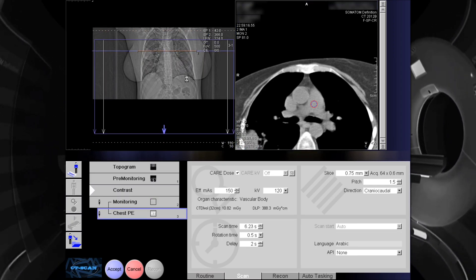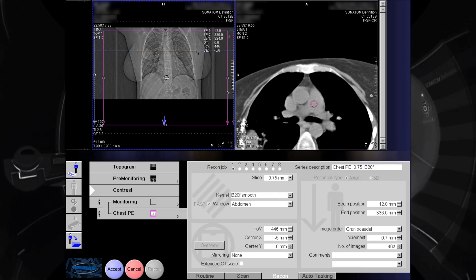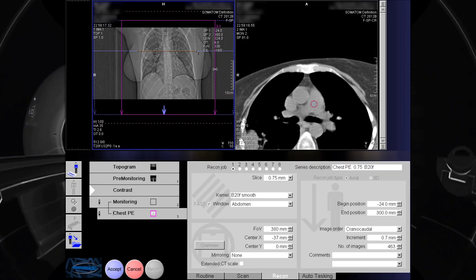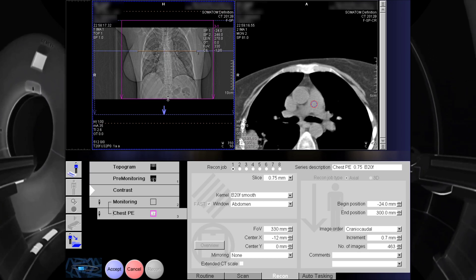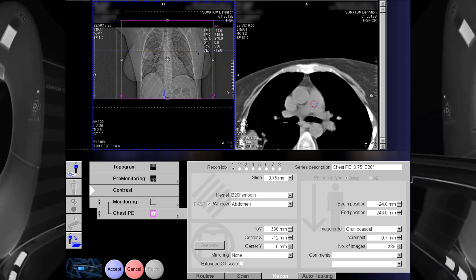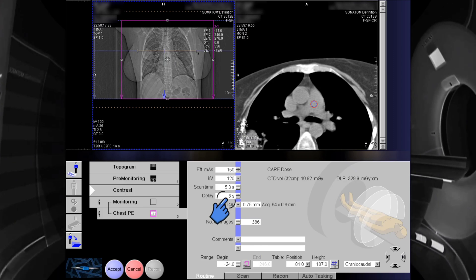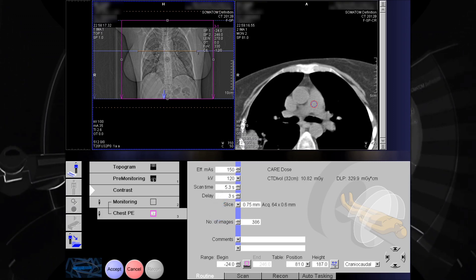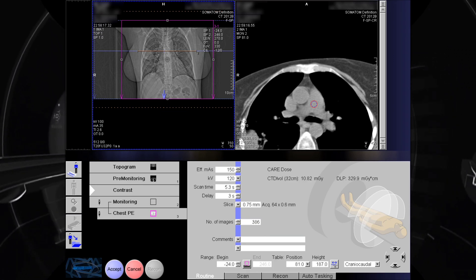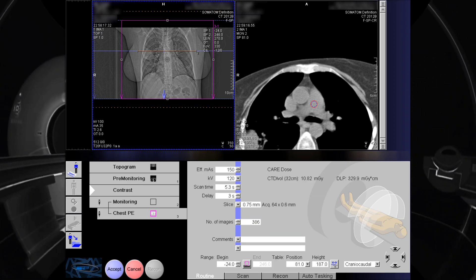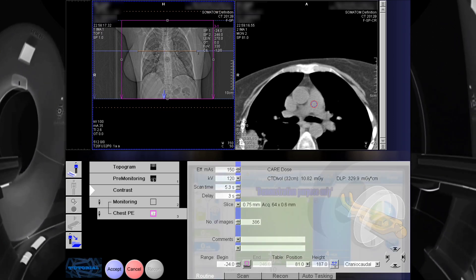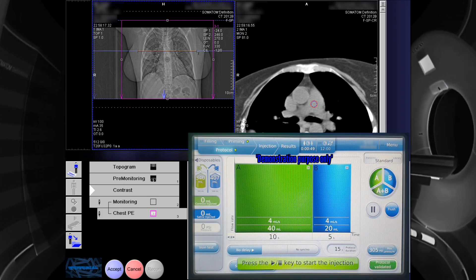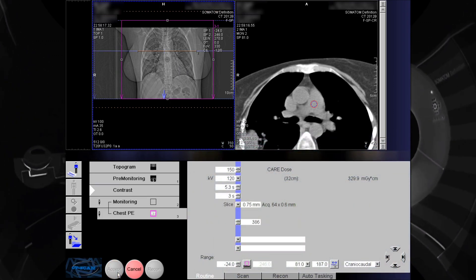Now, we are going to adjust our parameters for the final acquisition. Notice that there is a 3 seconds delay scan in the final acquisition, starting from the starting point of the parameter. Now we are going to set the amount of contrast to be given. When everything is all set up, click Accept.